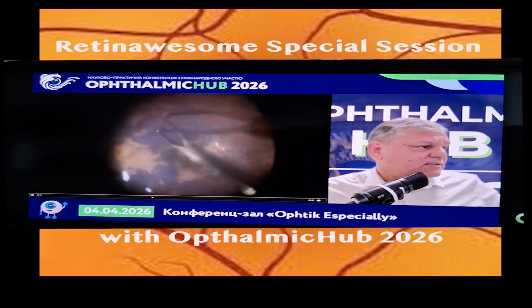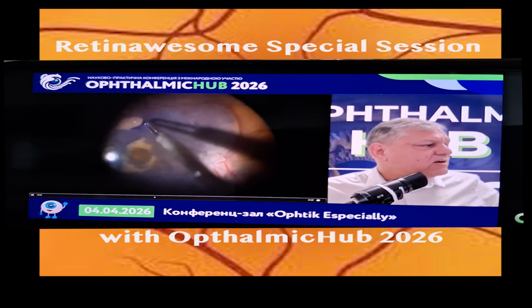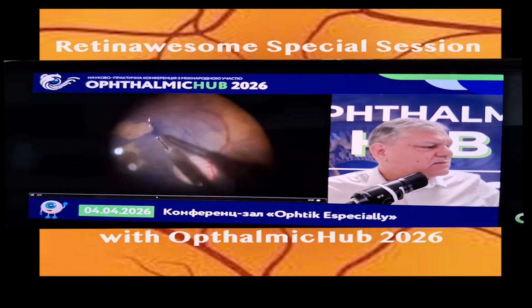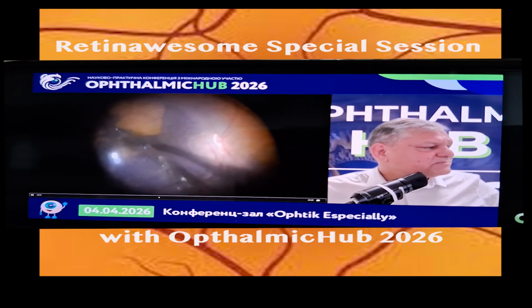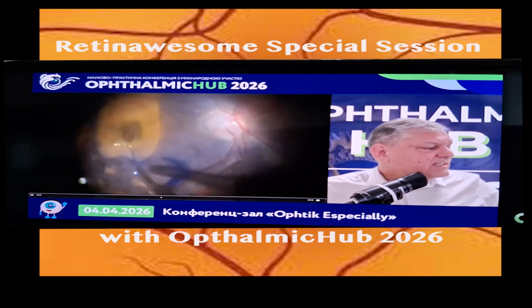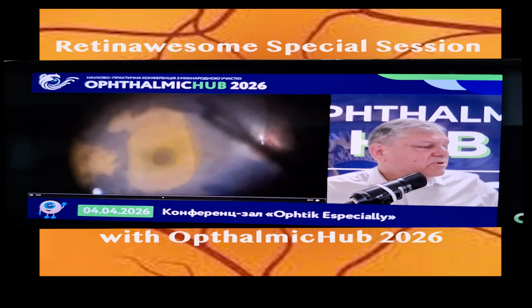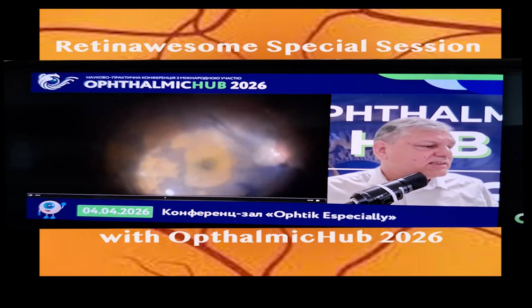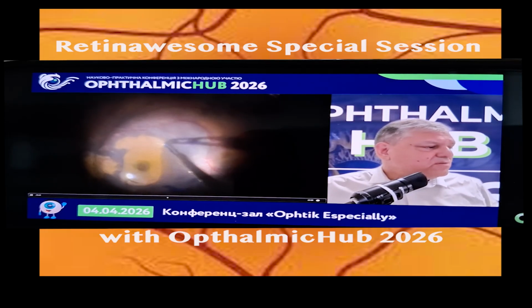Now, after doing further vitrectomy, I inject the fluorocarbon liquid again. And now let me go after the internal limiting membrane to do the peel very carefully. What is interesting here is that I'm doing the internal limiting membrane peel and leaving the ILM, I would say, on the floor, right there where you can see.